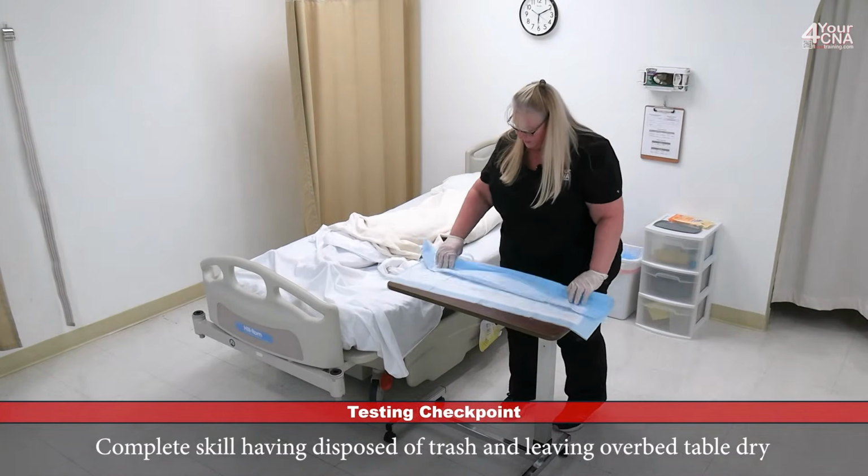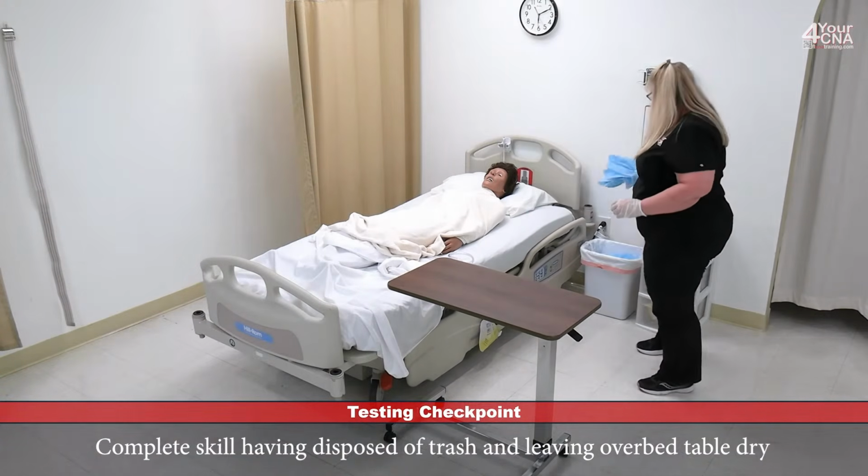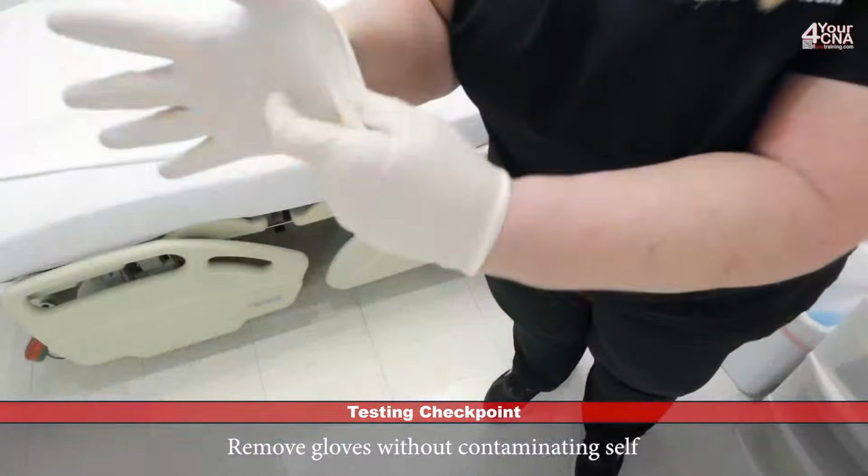Now we can dispose of the barrier. This will go in the garbage. And I can remove my gloves.